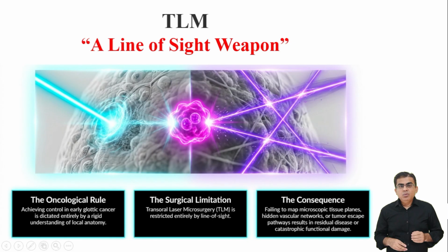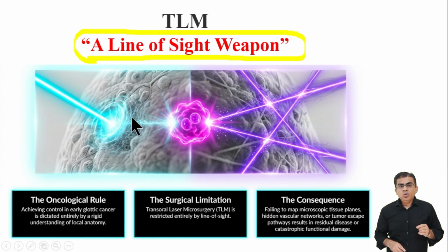Let us look at the most fundamental rule of laser surgery. TLM is a strict line of sight weapon. This means you can only cut what you can directly see through your microscope.